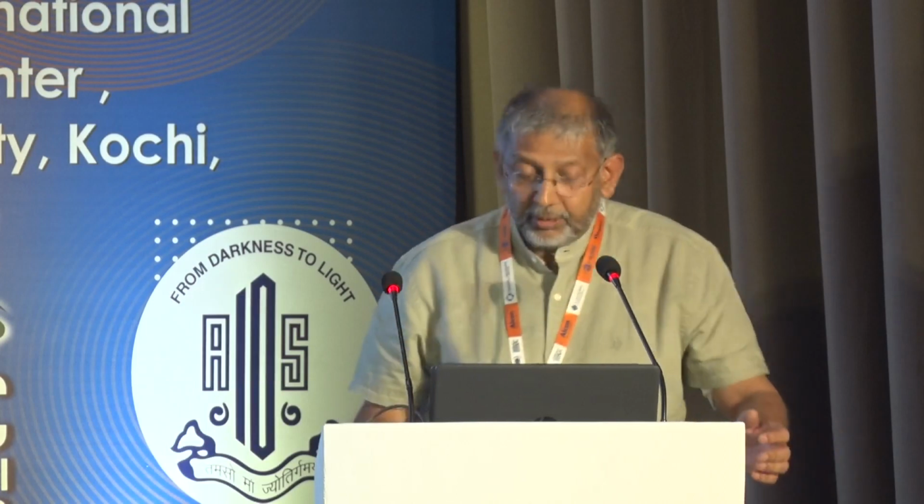There are plenty of aspheric lenses available in the market. They are aspheric neutral also. They have specific indications. So these are two eyes of the same patient. In one eye, we put a non-aspheric lens, and in the other eye, we put an aspheric lens, which has an asphericity of minus 0.21 micron, which is the IQ lens.